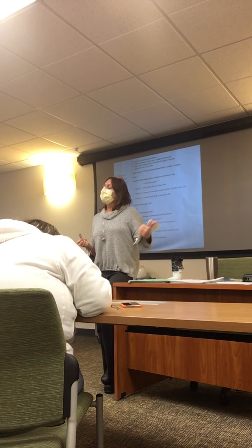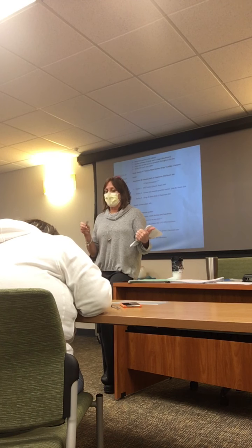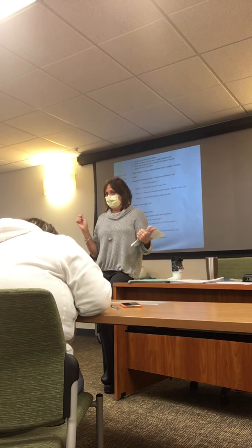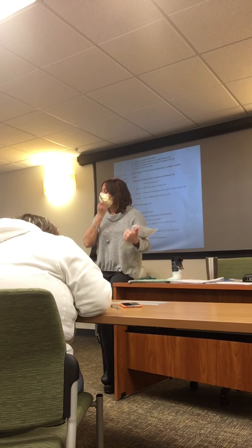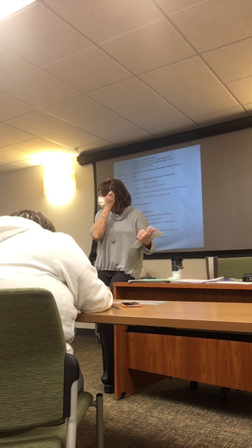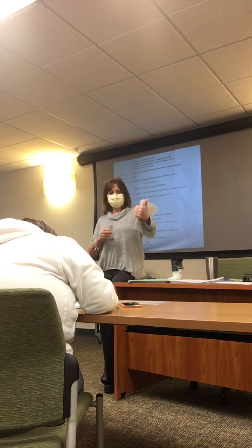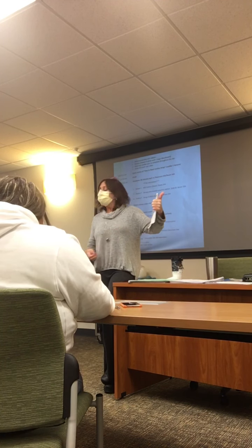Two. All right, so if I have 2 little boxes, the 0.04 times 2 is 0.08. All right, so is that normal? Yes, because what's a normal QRS complex? Good, so less than 0.12. So is the rhythm regular?